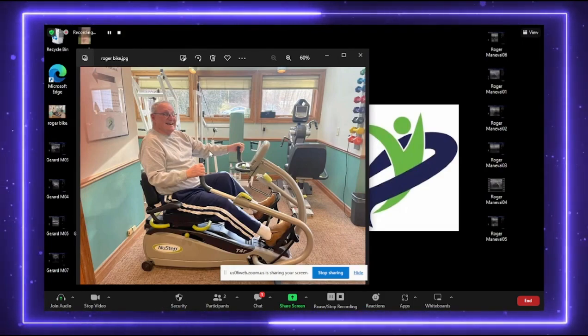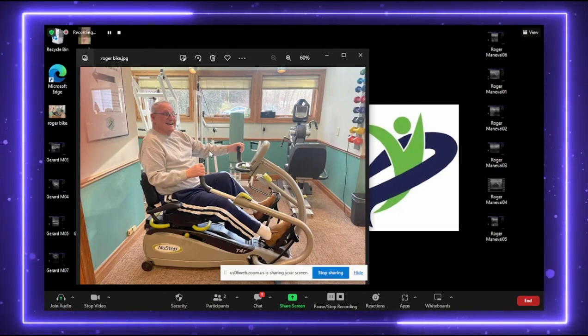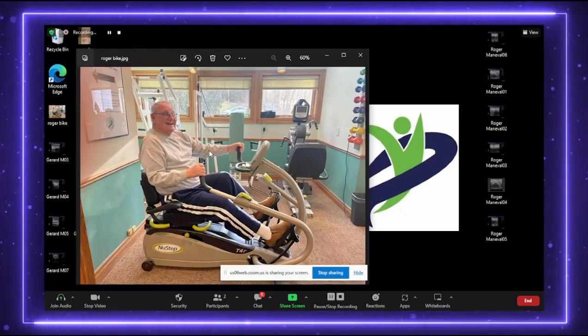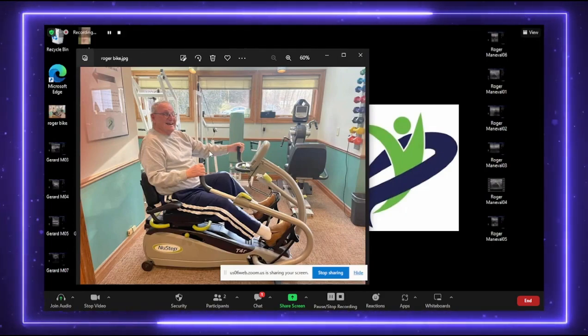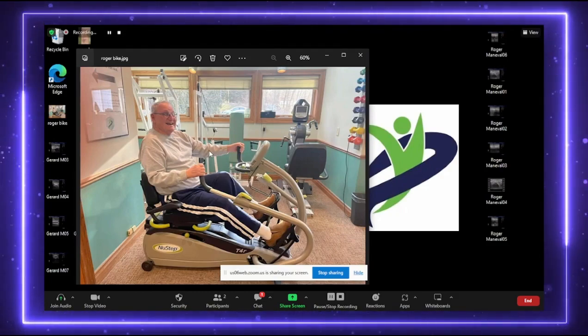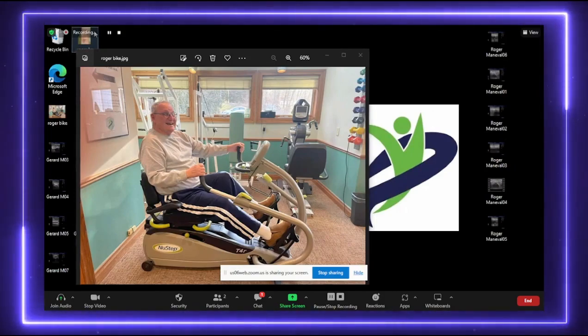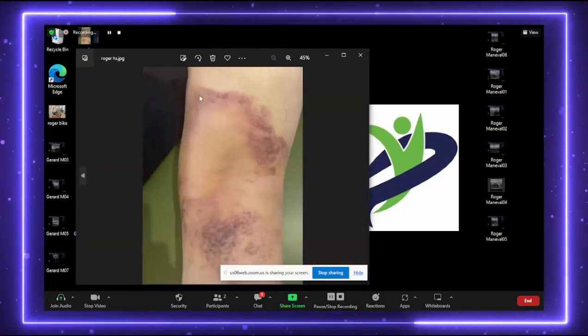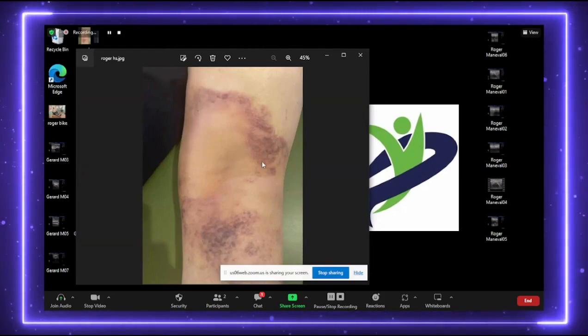I've worked on him. We treated not only his knee, but his foot and his ankle, his SI joint, his lumbar spine, both his hip capsules. I've got him to about 85 degrees worth of knee flexion. He's almost able to get out of a chair a little better. The ultrasound came in. His first day of physical therapy, this gentleman came in, and here's what I saw. He said, I was getting on the back of my ATV, and I heard a pop. And this is his popliteal fossa.